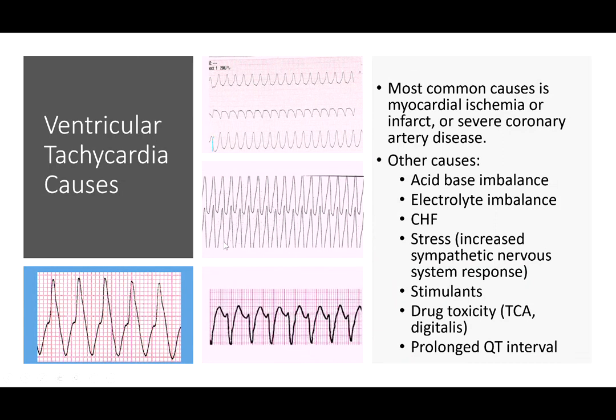So I put a lot of different examples of VTach here. Basically, the faster the VTach gets, this one is about, I can't remember, this patient was about 220 times a minute. So this rate is about 220. I know the blocks aren't on there. But very, very fast VTach.